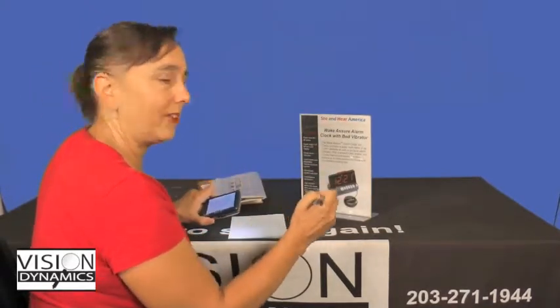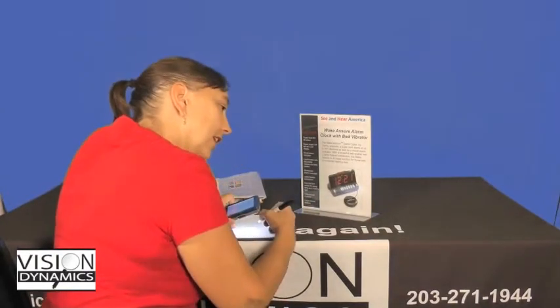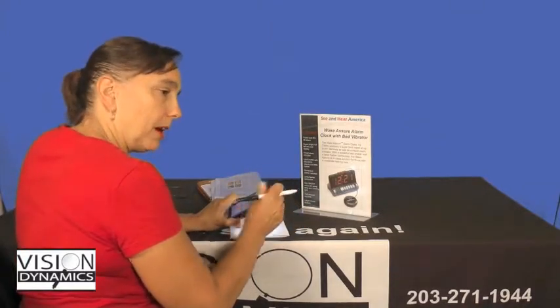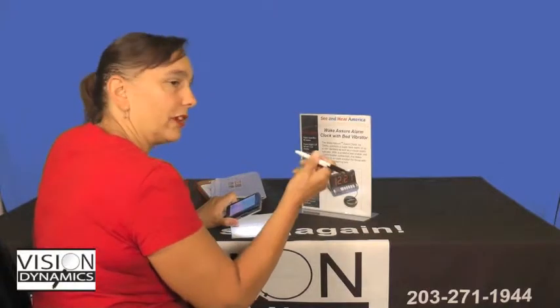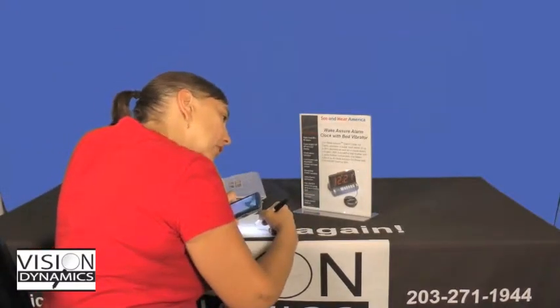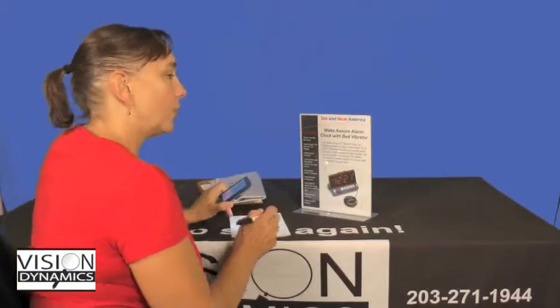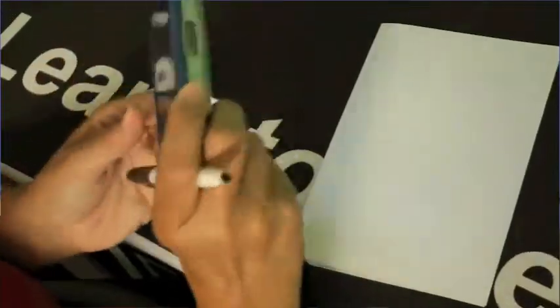But if I quick need to sign something or fill out a total on a receipt, I can do that just by watching through the screen, tipping it up so the camera sees the tip of my pen, and I can see. I use a nice 20/20 pen where I've got a very white shaft and a black tip at the end of the pen so I can see it nice and clear, and I can do a quick signature. So practice at home, make an X on a line so you can practice signing a receipt.